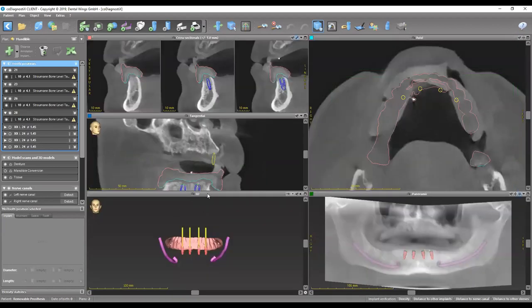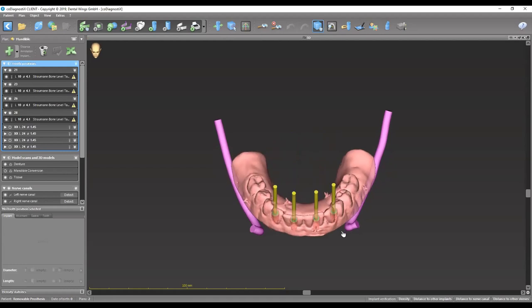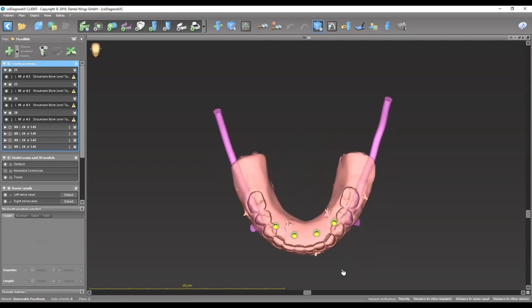We're going to be placing four implants. We've decided to place them at the sites of the first bicuspids and the lateral incisors. Taking a closer look at the occlusal view, we have some criteria for designing a case to accommodate an overdenture. First, we want to make sure we have enough vertical clearance. According to literature, we need around 10 to 12 millimeters from the implant platform to the occlusal table to have enough bulk for the prosthesis and for placing the housings into the denture.